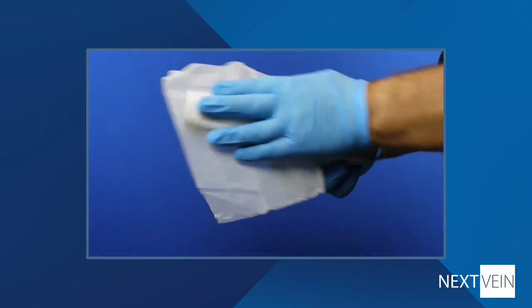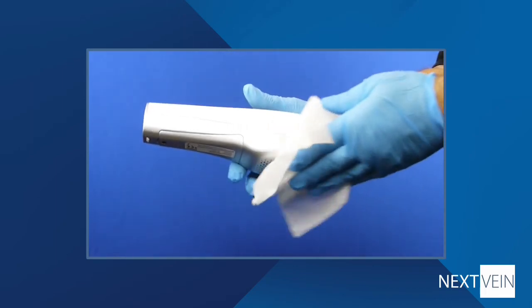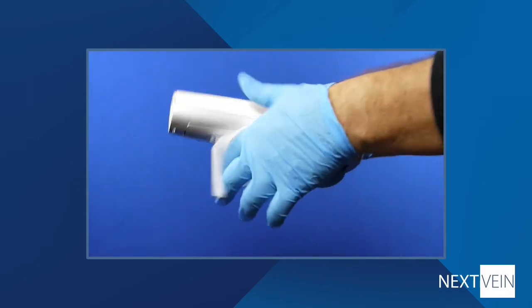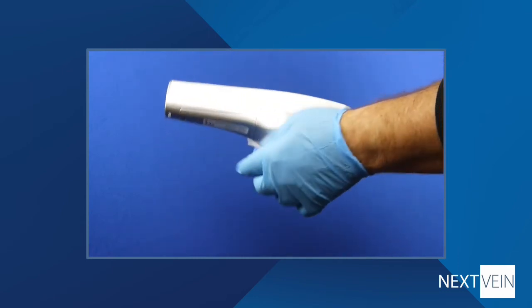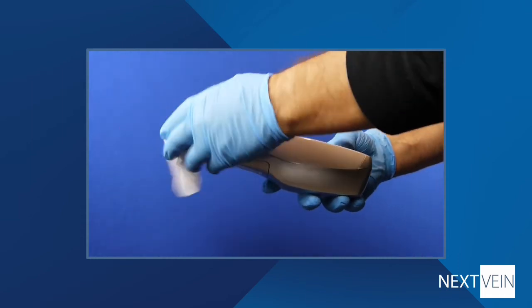Always follow your facility's cleaning protocols. To clean the device, use a pre-moistened towel with 75% alcohol or benzalkonium bromide. Please check our support site at support.nexvein.com for other approved materials. Make sure that the cloth is damp, not wet, as it's important to avoid getting liquids inside the device. If you happen to notice a spot or spots on the projection that move as the device moves, it indicates that the projector lens is dirty. Use an alcohol wipe to clean the lens to remove the spots.